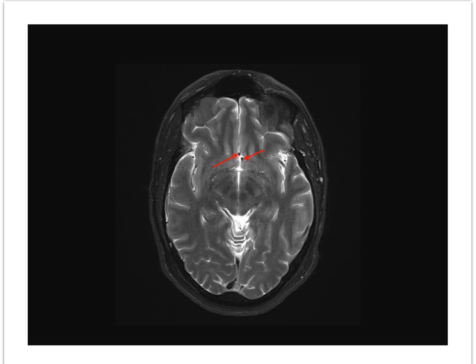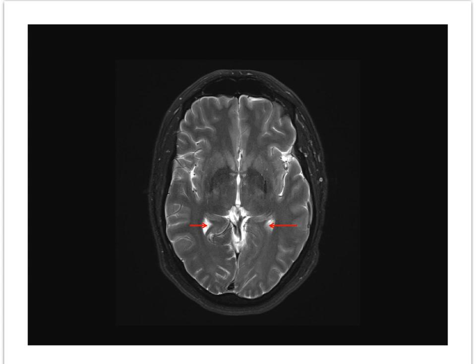These arrows point out the bilateral anterior cerebral arteries, which course in the longitudinal sulcus anterior to the anterior commissure. At the next level up we are able to see CSF in the atria of the lateral ventricles. The atria are bounded medially by the isthmus of the cingulate gyrus that turns into the parahippocampal gyrus just beneath the splenium of the corpus callosum.